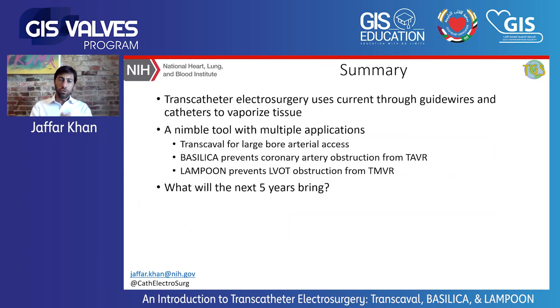So, to bring the whole talk to a close, transcatheter electrosurgery uses current through guide wires to vaporize tissue. It's a really nimble tool. It has multiple applications. I've described three of these applications today. That's transcaval access for large bore arterial access, BASILICA, which prevents coronary obstruction from TAVR, and LAMPOON, which prevents LVOT obstruction from TMVR.